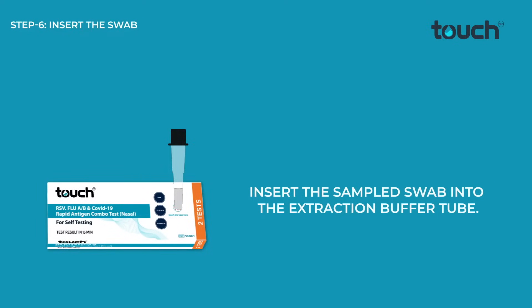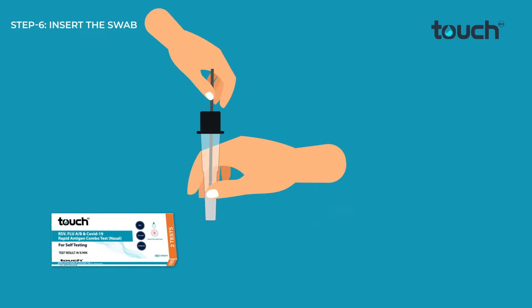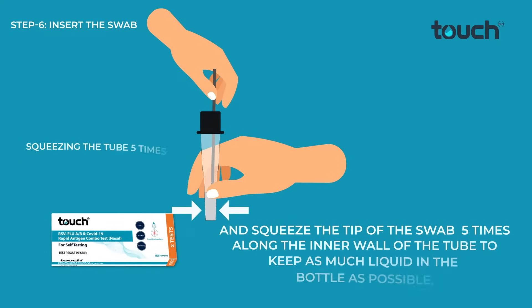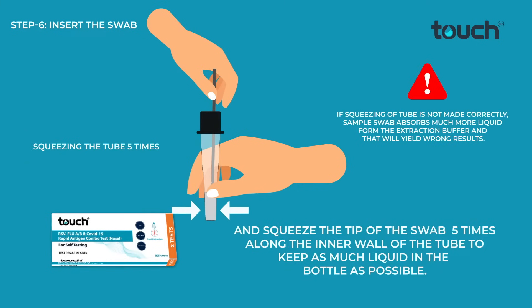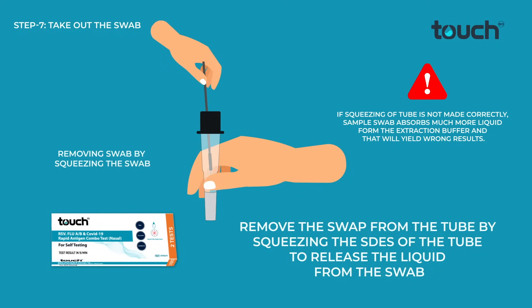Insert the sampled swab into the extraction buffer tube and dip the tip into the extraction buffer. Rotate the swab tip 10 times along the inner wall of the buffer tube and squeeze the tip of the swab 5 times along the inner wall of the tube to keep as much liquid in the bottle as possible. Remove the swab from the tube by squeezing the sides of the tube to release the liquid from the swab.